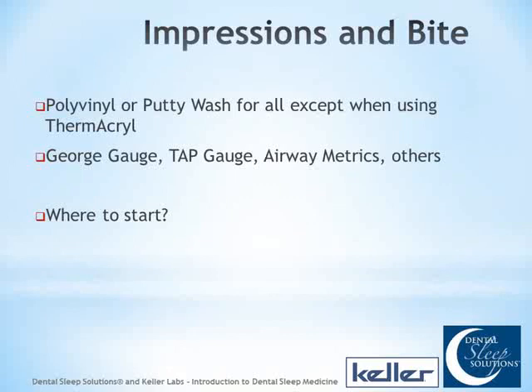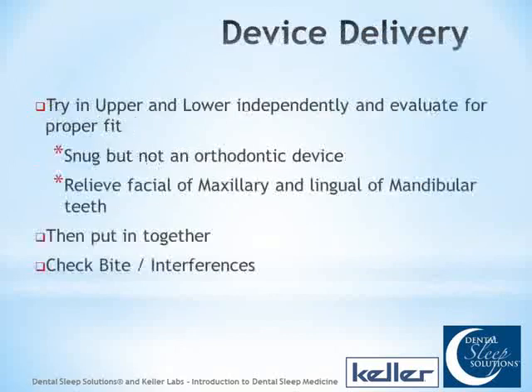Okay, device delivery. We've actually finally got the patient to where we've taken the impressions and the bite, and we've sent it off to Keller. They're going to give us our device back. The tap, we're just going to try in the top. We're going to try in the bottom or the EMA, either one. We're going to check how they fit independently of each other, and then we're actually going to either hook the tap together or hook the bands up to that and put them in together.